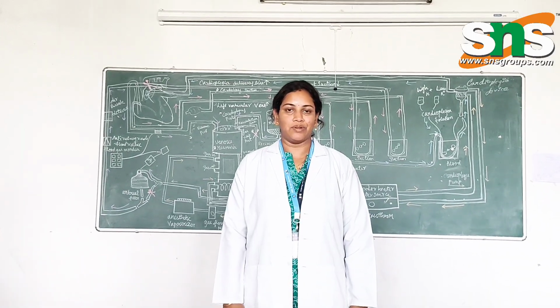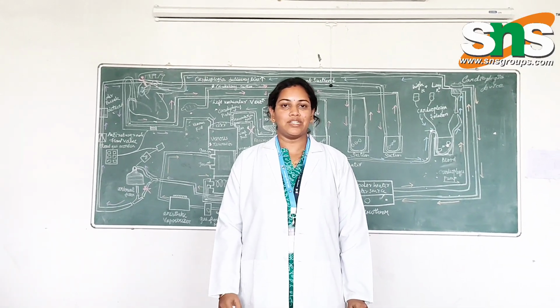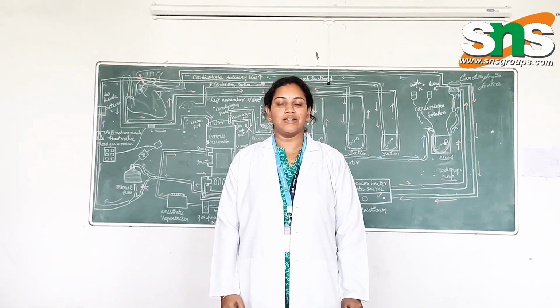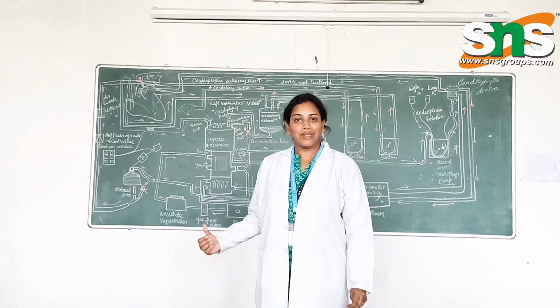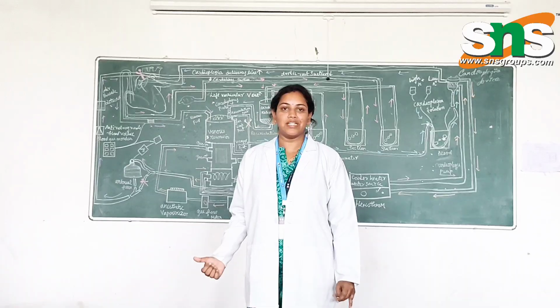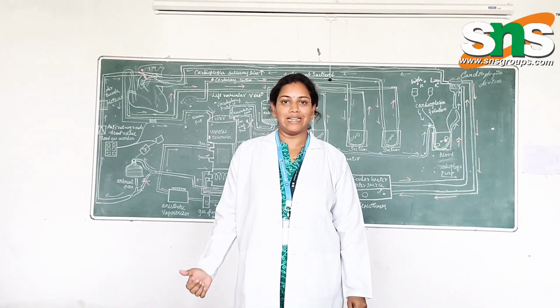Our students are going to describe the cardiopulmonary bypass circuit. Cardiopulmonary bypass is a procedure which temporarily takes over the function of the heart and lungs during surgery. Here is a circuit diagram. It looks very complex, but our students will represent every component in a detailed manner.